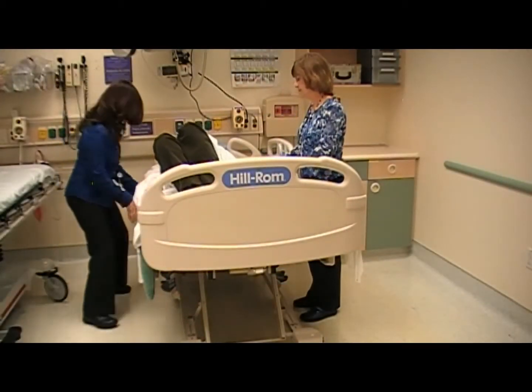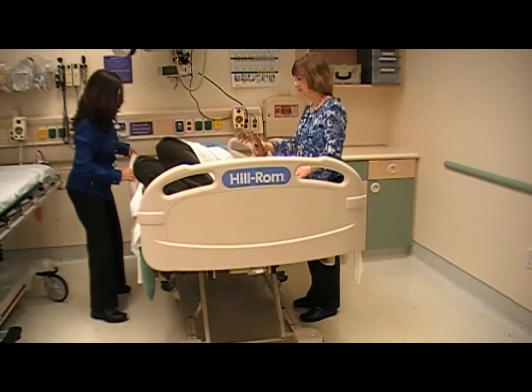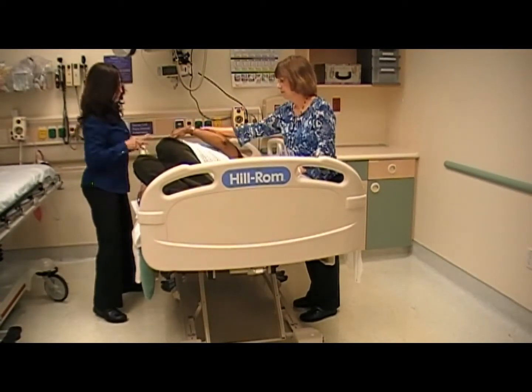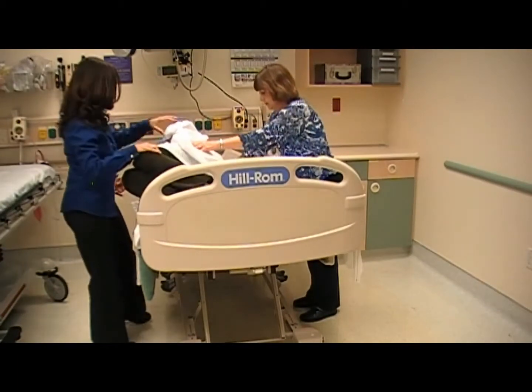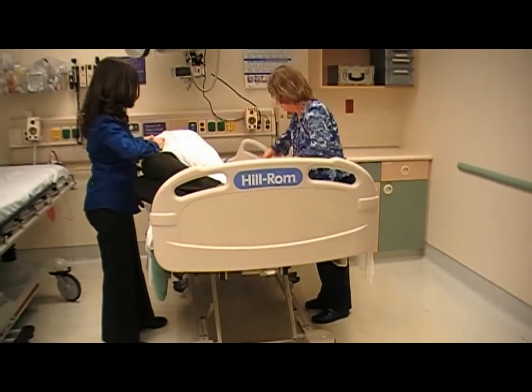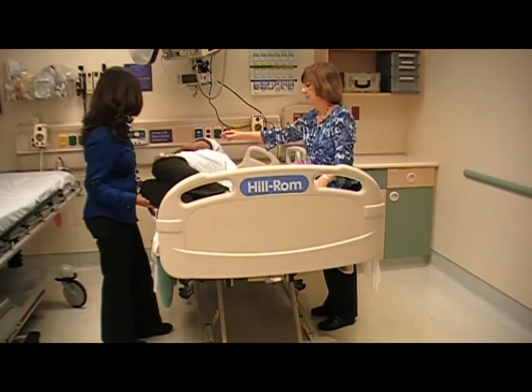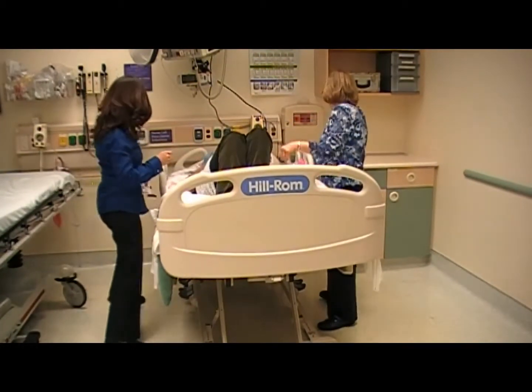Release the patient and repeat turning technique in the other direction in order to pull the pink slip through to the other side. If only one healthcare worker, be sure to use the bed rails when changing sides. Make sure the pink slip is under the shoulders, head, and hips of the patient.